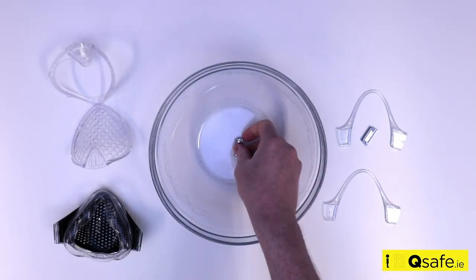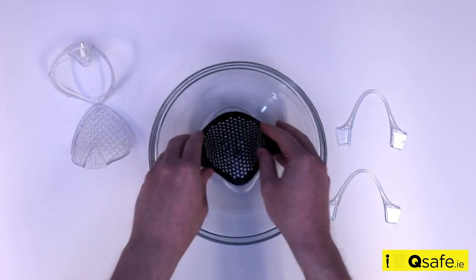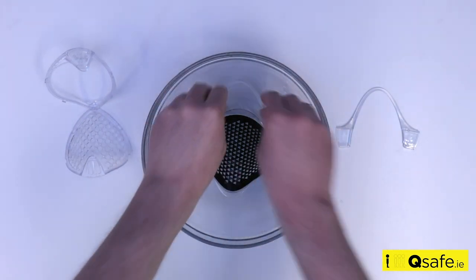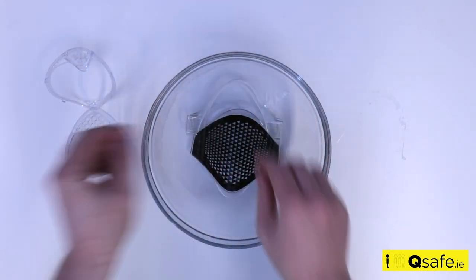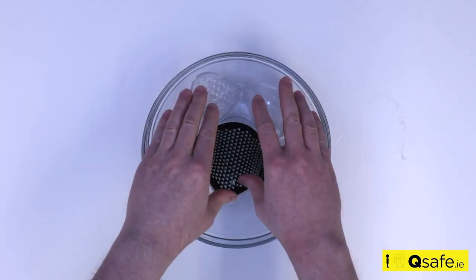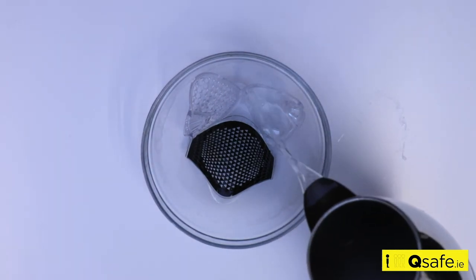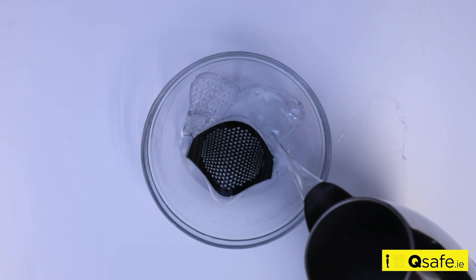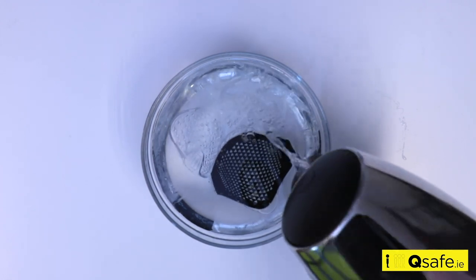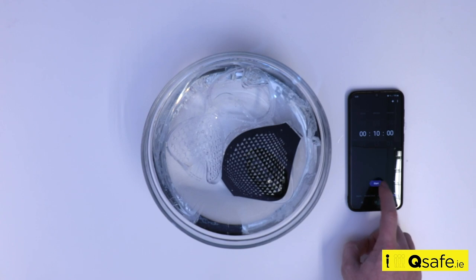To sterilize the face mask, place the silver clasps, the silicone face mask, silicone ear hooks, and the filter housing in an empty container, and fill with boiling water. Do not place the headband straps in boiling water. Leave to soak for 10 minutes.